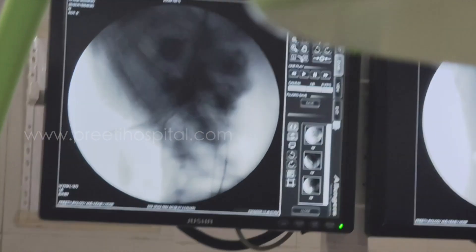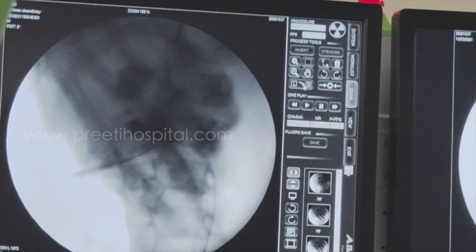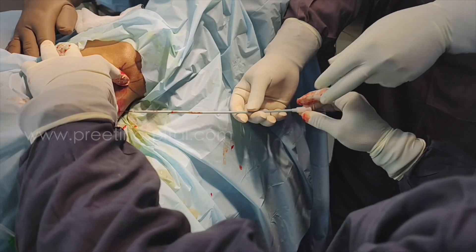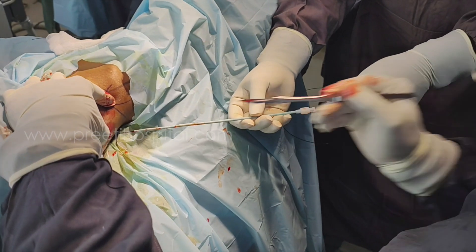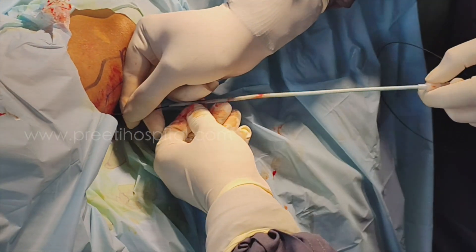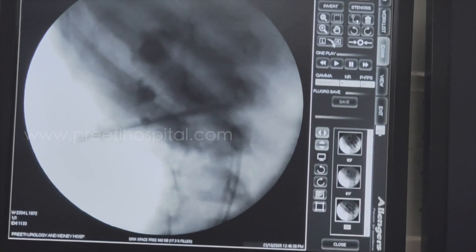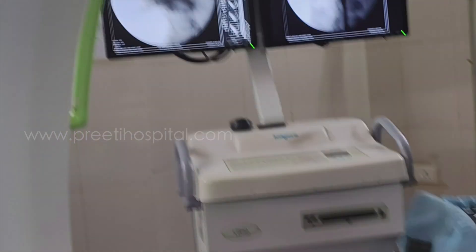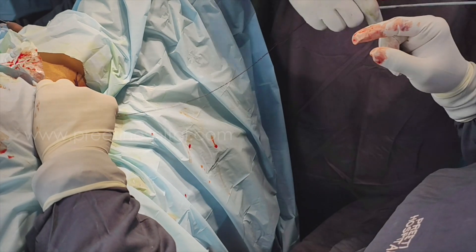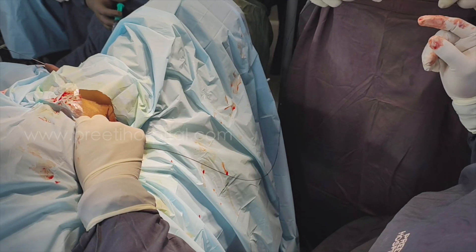Here also I am facing a lot of problems. The skin incision I have not given properly — the dermis I have not cut. You should understand these points. I have done it with my experience, but properly you should cut it. See, it goes easily now. Only thing is that you need to properly perforate the skin. That is why you should always use the zebra guidewire — zebra is stiffer and better. Now rod. Whenever you insert the rod, you should take an RGP as a background.